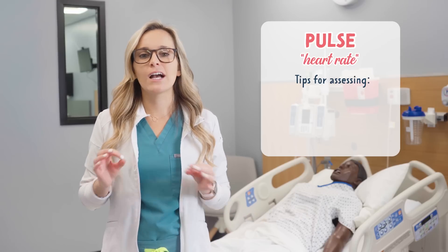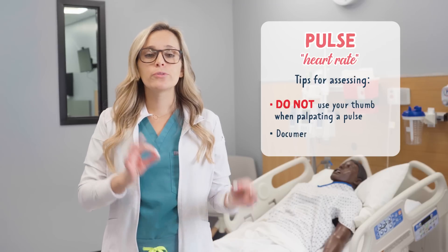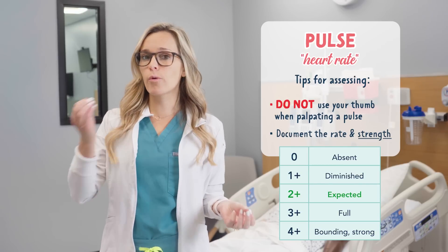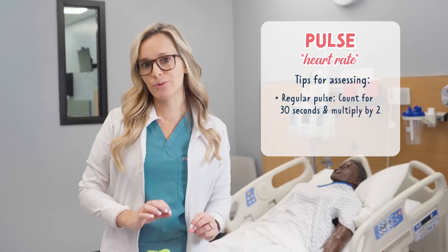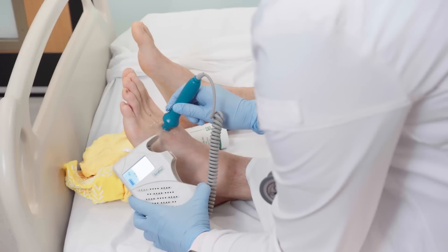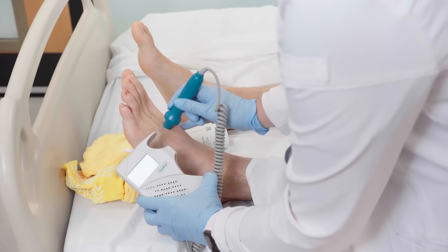Now let's look at some tips for assessing a pulse. You do not want to use your thumb when palpating a pulse — your thumb actually has its own pulse that you may mistake as your patient's. Be sure to determine the rate and the strength of the pulse. We assess the strength on a pulse scale, rating it from 0 to 4+. If the patient has a regular pulse and no cardiac issues are present, you can count for 30 seconds and multiply that number by 2. And the last tip is to use a Doppler device if you're having trouble finding a pulse. A pro tip: if a pulse is found using a Doppler, mark the location with a skin-safe marker so you or someone else can easily find it next time.